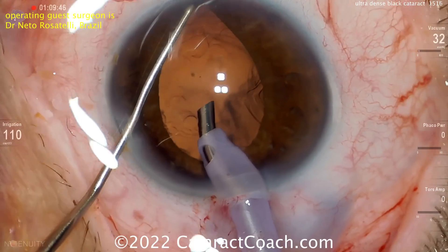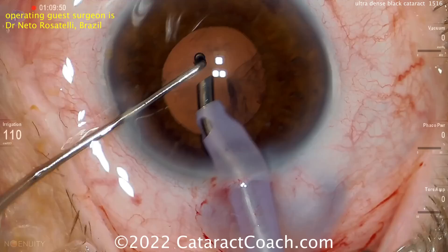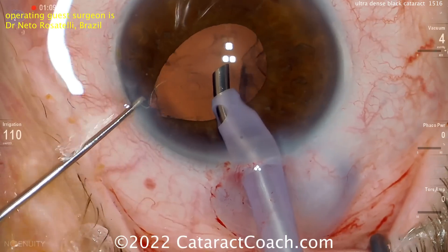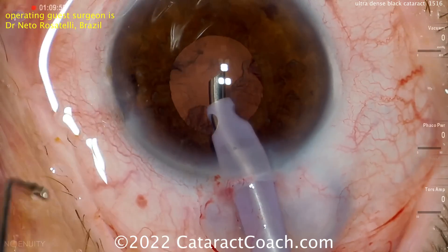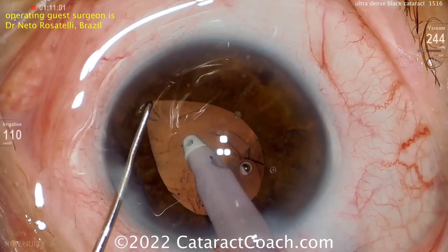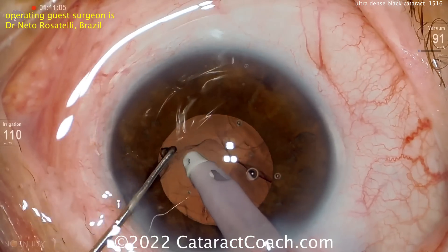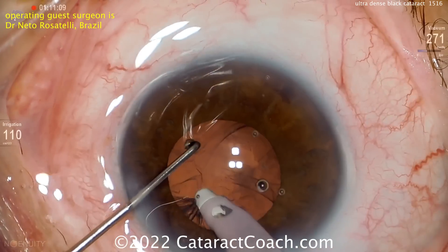The cataract is now out of the eye. Smart move: making sure there are no chunks of nucleus or small fragments hidden under the iris, because this is not the best dilation. That is something you learn the hard way, and he's done a beautiful job of it — no retained pieces, because the pupil wants to come down. He's using the chopper to lift up the iris for better visualization while the irrigation/aspiration probe removes all the cortex.